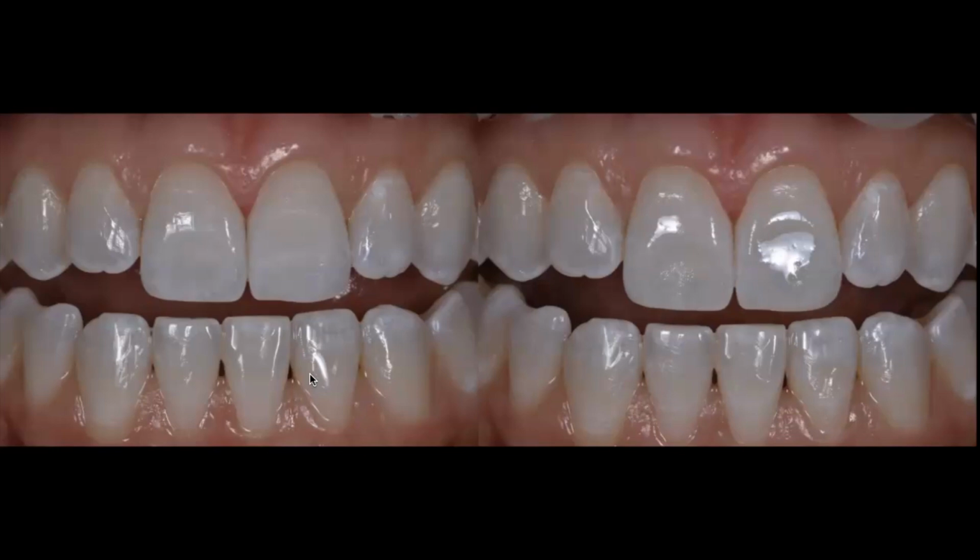which is applying the resin infiltrant. The system comes with a very nice applicator. You saturate that with a very flowable, clear resin that you apply on the tooth, and you brush it on top of the tooth multiple times, I would say for 30 to 40 seconds, because you want to make sure that you saturate all this etched enamel so that this very fine unfilled resin infiltrates within all those micropores that you've created on that enamel. Once you apply it multiple times and make sure that you saturate it, you eliminate the excess, and then you go ahead and light cure.